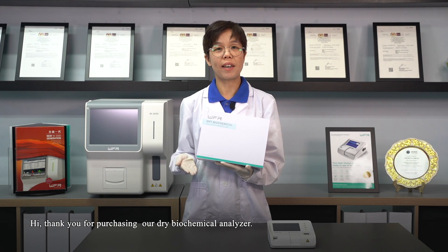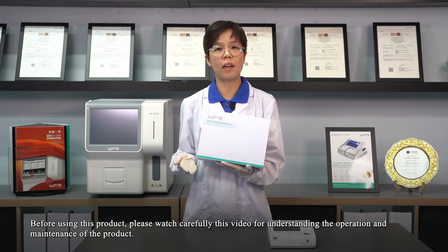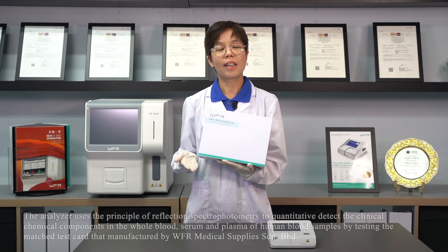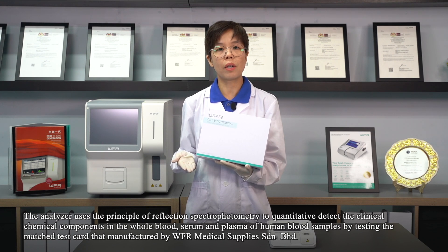Hi, thank you for purchasing our Dry Biochemical Analyzer. Before using this product, please watch carefully this video for understanding the operation and maintenance of the product. The Dry Biochemical Analyzer is a portable, dry biochemical quantitative analysis instrument. The analyzer uses the principle of reflection spectrophotometry to quantitatively detect clinical chemical components in the whole blood, serum, and plasma of human blood samples by testing the matching test card manufactured by WFR Medical Supplies Sdn. Bhd..